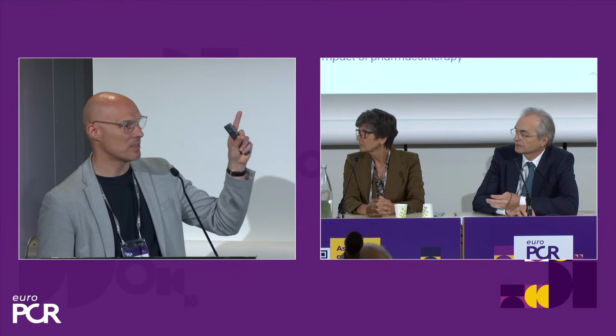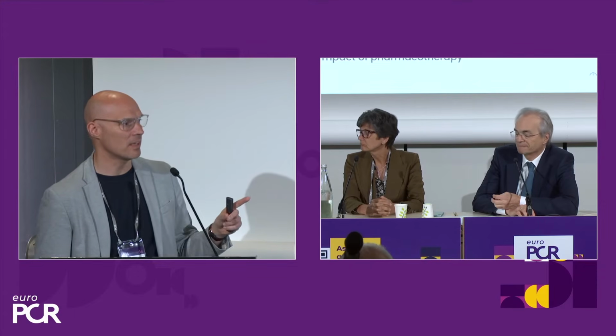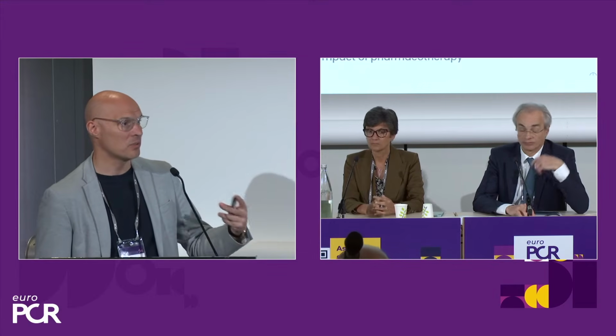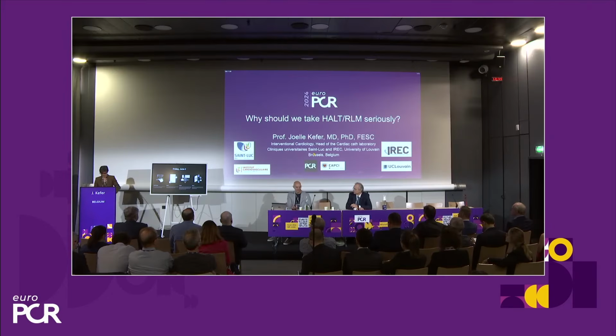I think that's a very important comment. So echocardiography by itself cannot be our go-to imaging modality for the diagnosis of this specific entity. You really need CT scanning, and you would miss a lot of those cases if you only rely on echo. That said, the triggers are an increase in gradient, but also some clinical triggers, for instance, systemic embolizations or neurological events. Okay, so with that, I think we go to the second question, and that is, should we take HALT and reduced leaflet mobility seriously?